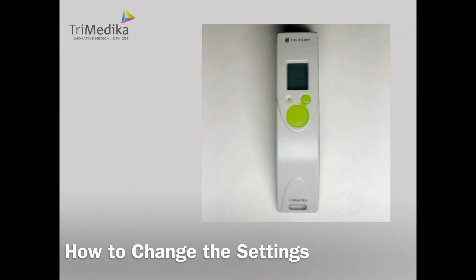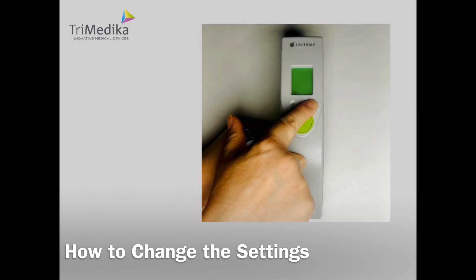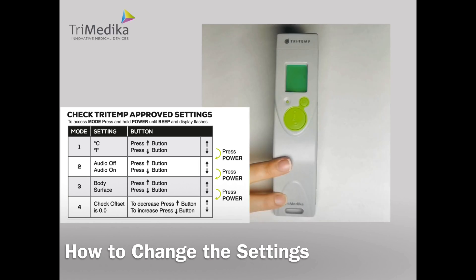Now let's have a look at how to change the settings. To access the settings mode, press the power button until it beeps. There are four modes in the settings. Mode 1 allows you to select either Celsius or Fahrenheit. To change from Celsius to Fahrenheit press down, and to go back to Celsius press up. Press OK to select.